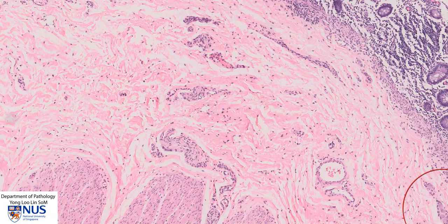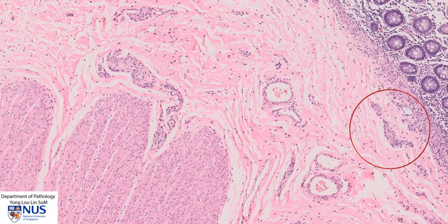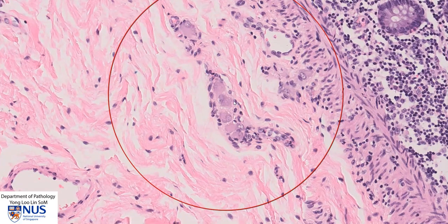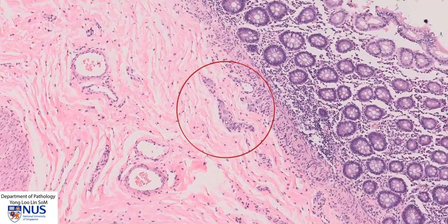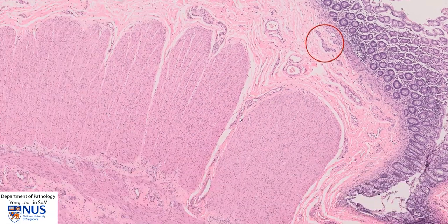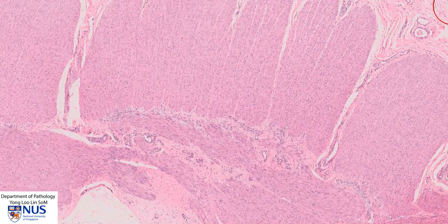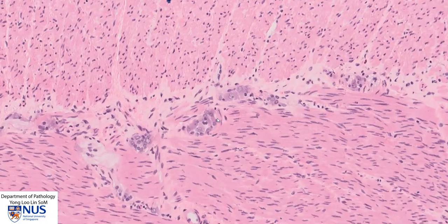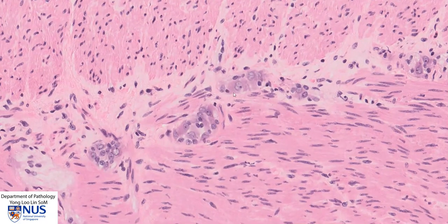Here again we have another small nerve twig, another one here, and over here again we can see the presence of some of these very distinctive ganglion cells. Moving downwards into the myenteric plexus, we would expect to see it here between the two layers of smooth muscle. And over here again, we can see very clearly the presence of ganglion cells — there is another one here, as well as here and here.